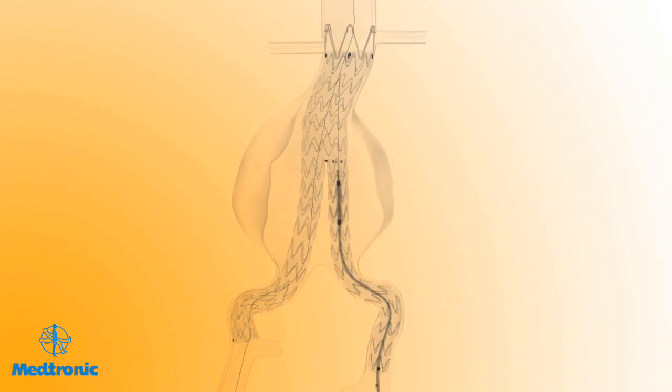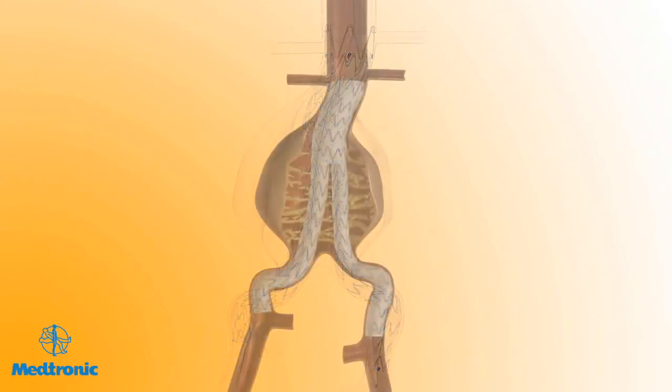Be careful to inflate the balloon only within the covered portion of the stent graft material. Deflate the balloon and repeat inflations and deflations as required within the covered stent graft material. Remove the Reliant balloon catheter from the patient when balloon modeling is complete.